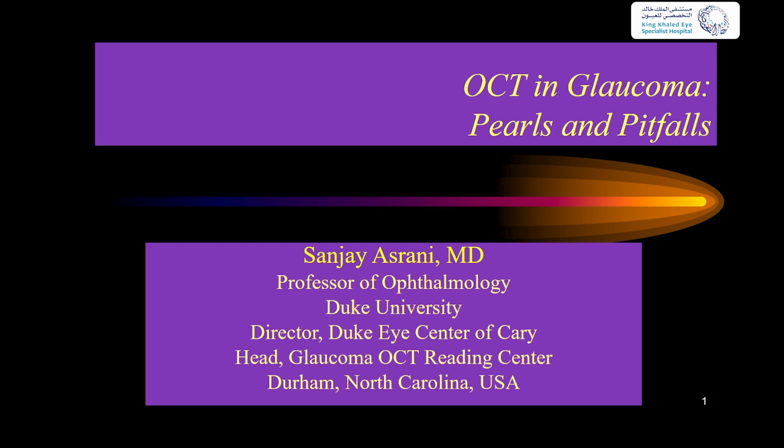The second clue that I will give you is to look at it with a green light at the slit lamp with a 78 diopter lens, or get a multicolor. And you can see the nerve fiber layer, and you can look at that thickness and see if defects are developing. But you're absolutely right. In patients who got staphylomas, high myopia, like -10, OCT is virtually useless in those cases where it's just not getting the scan.